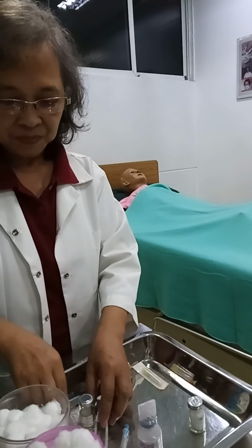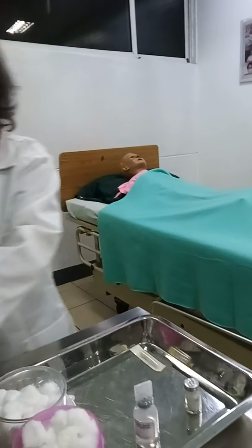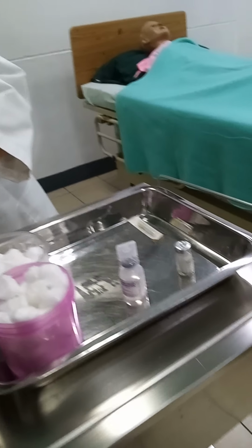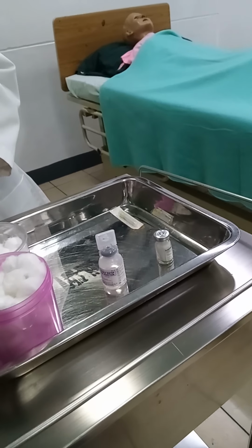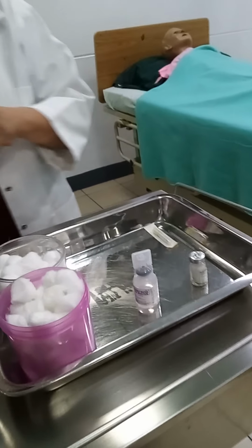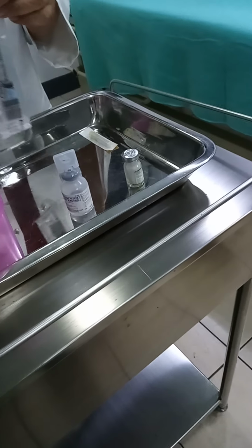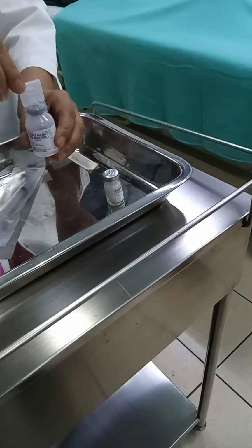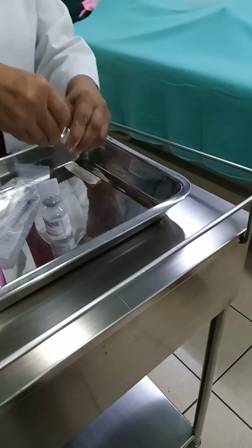Now we go to a vial containing a powder form. Remove the cap covering the vial of powdered medication and the cap covering the vial of diluent.